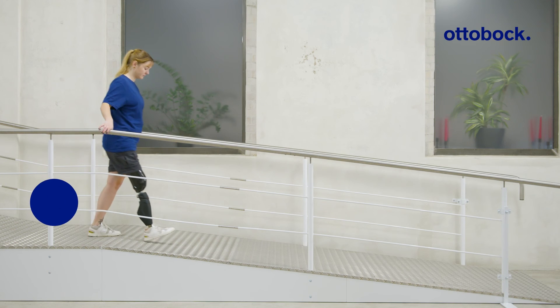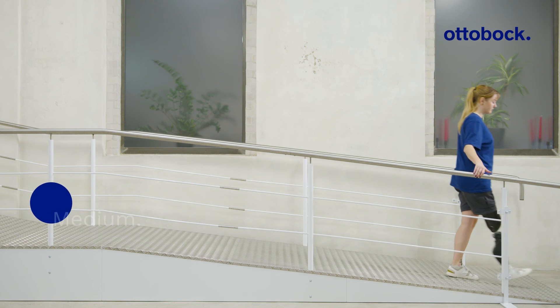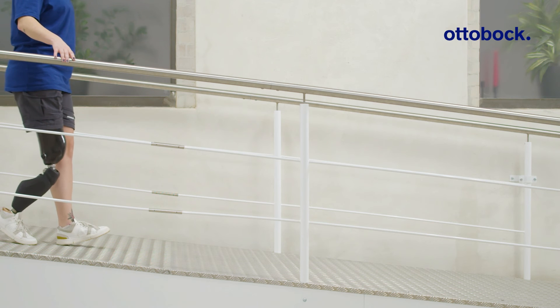Even with higher support, there is sufficient toe clearance on shallow slopes, since the yielding function adapts dynamically to the decline.